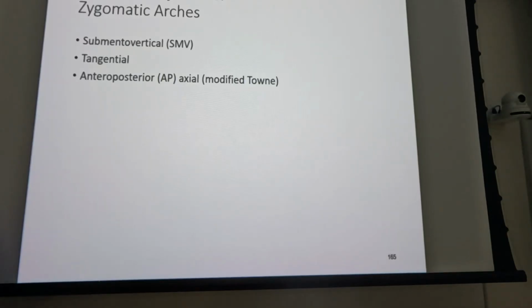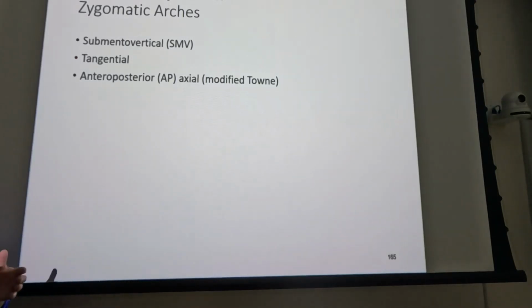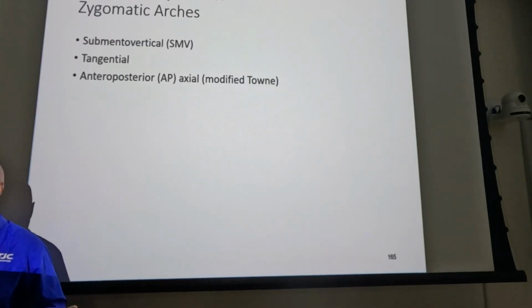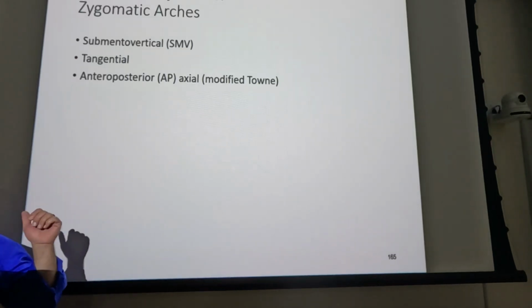So you can do this tabletop. It gives you more positioning latitude. It's easier to accomplish with the patient on the table. Positioning-wise, it's identical. Infraorbital meatal line needs to be parallel to the image receptor. If you can't get that, then your central ray needs to be perpendicular to the infraorbital meatal line. So your positioning latitude is that you can take the bucky out and shoot it tabletop.